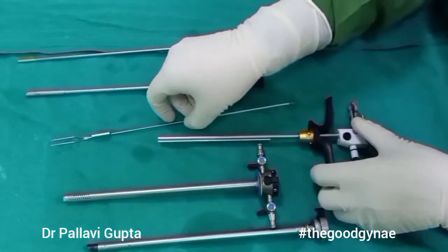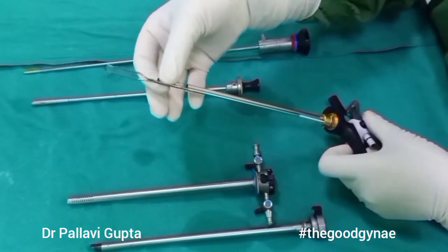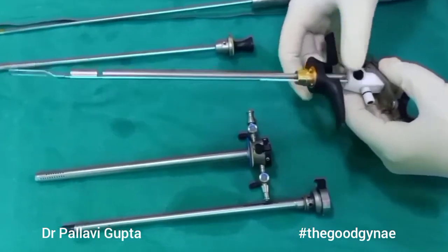We are going to take our working element and insert the electrode into it. Note that the electrode has a small tube in it which should align with the tube of the working element.